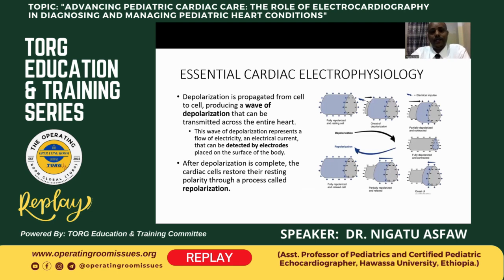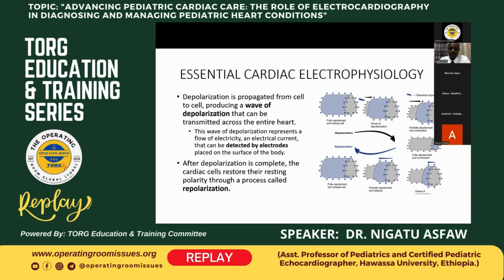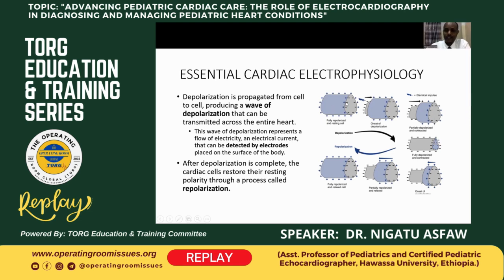Let me talk about essential cardiac electrophysiology. When we talk about ECG waves in ECG leads, we are talking about millions of myocardial cells picked up by the electrodes, and these are waves of depolarization and repolarization of myocytes. When a cell is fully repolarized, it is in resting state and is negative inside and positive outside.